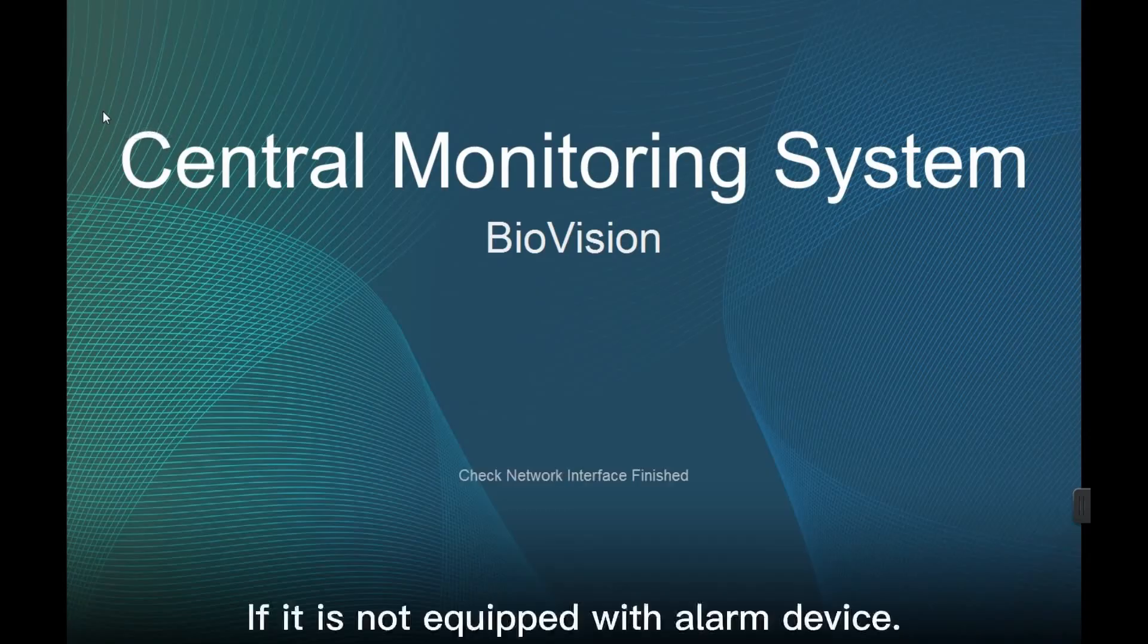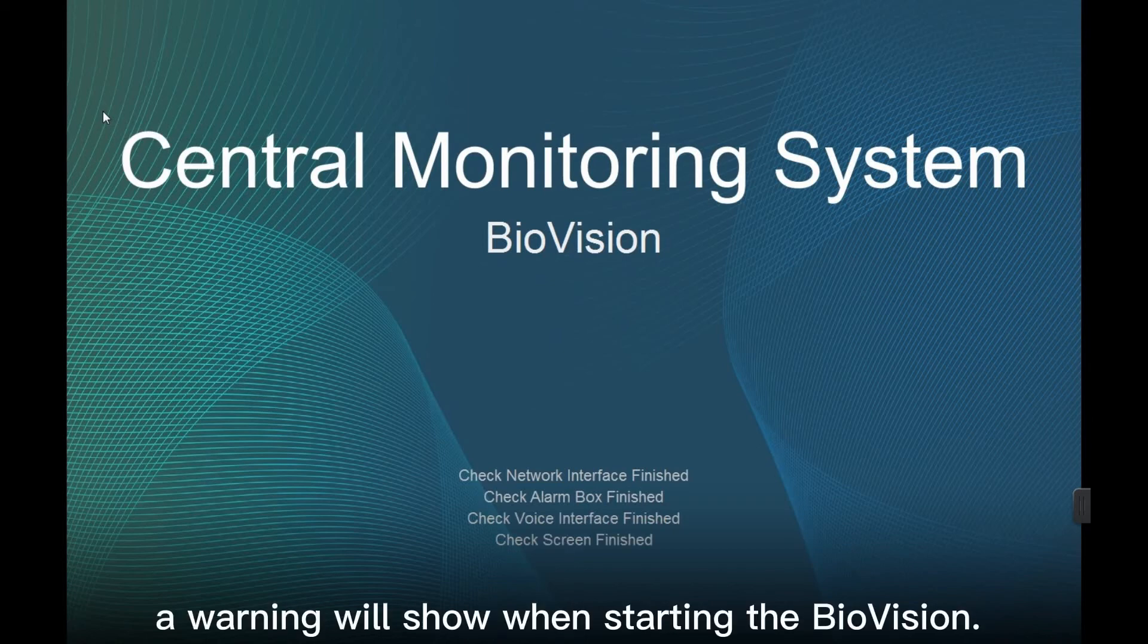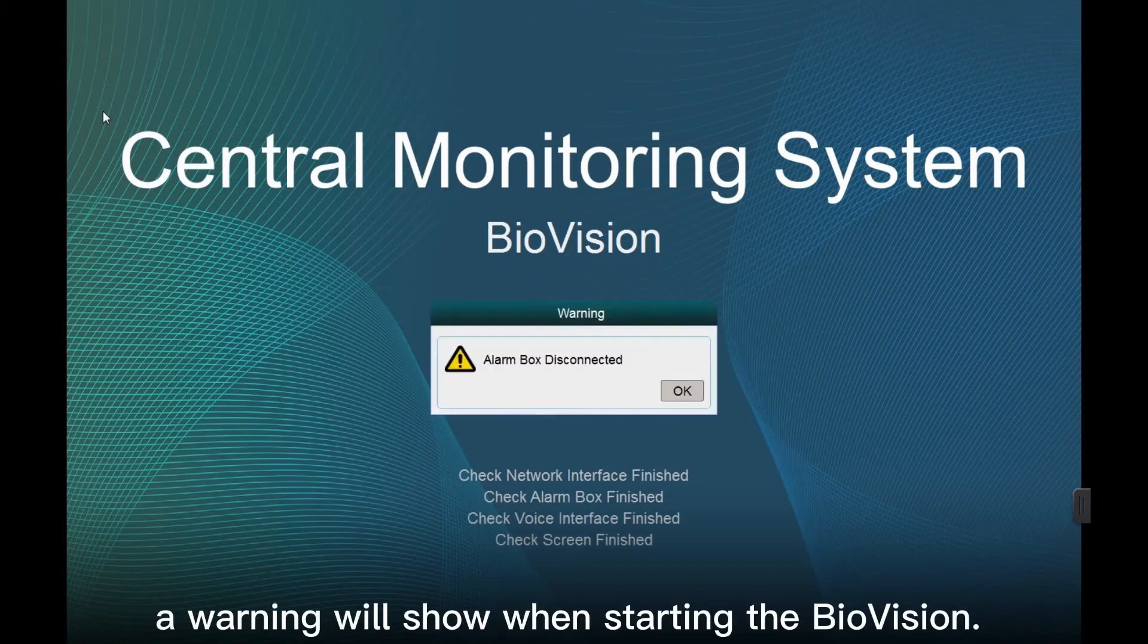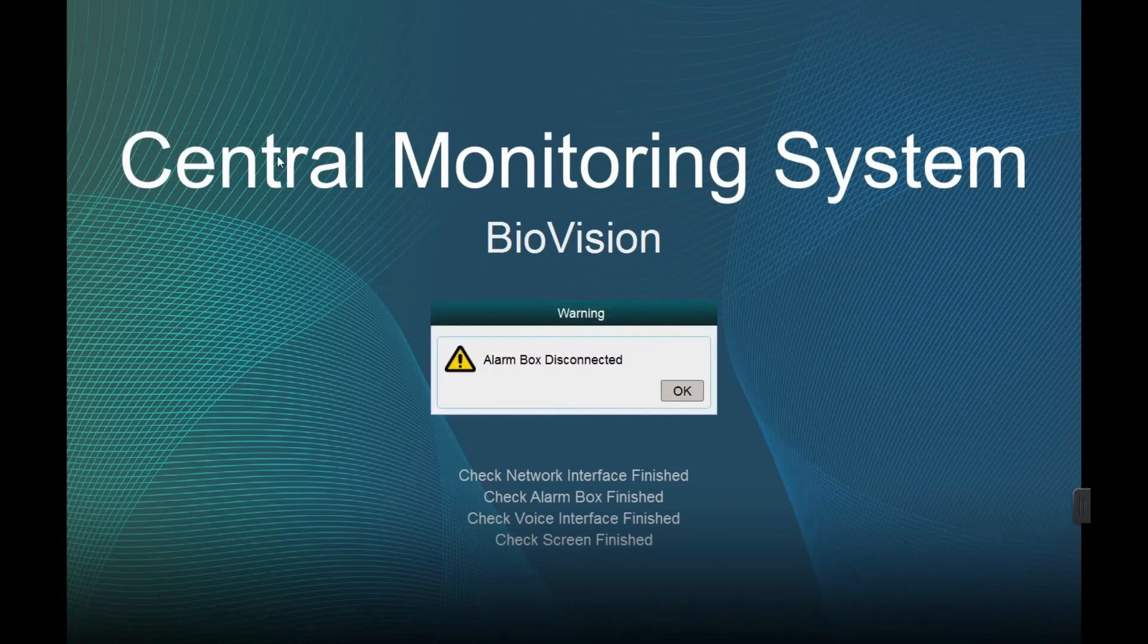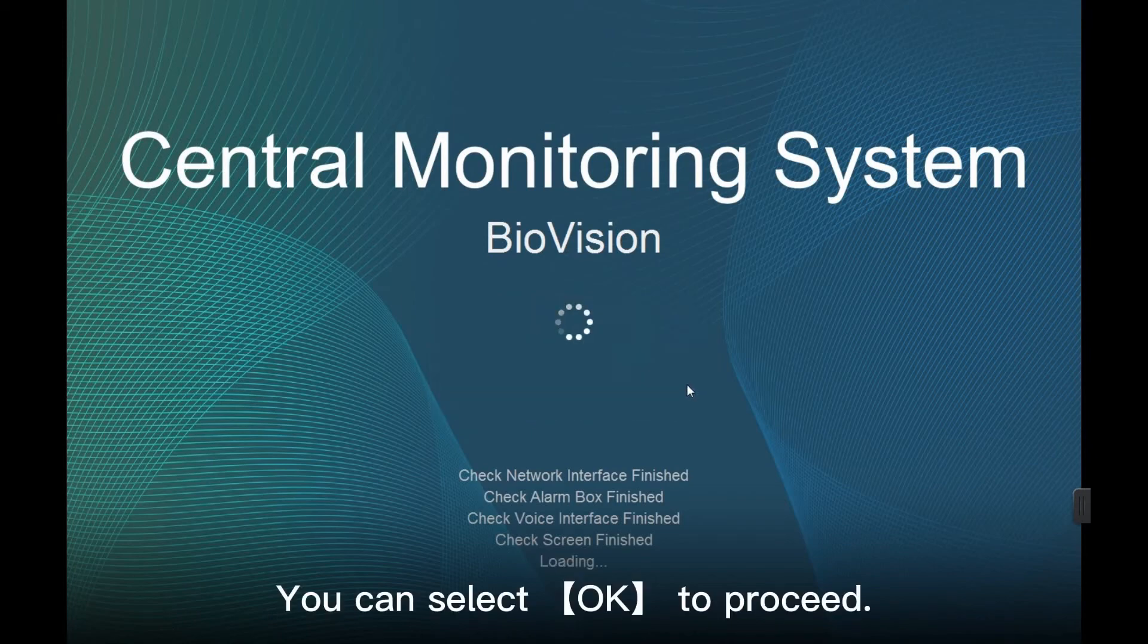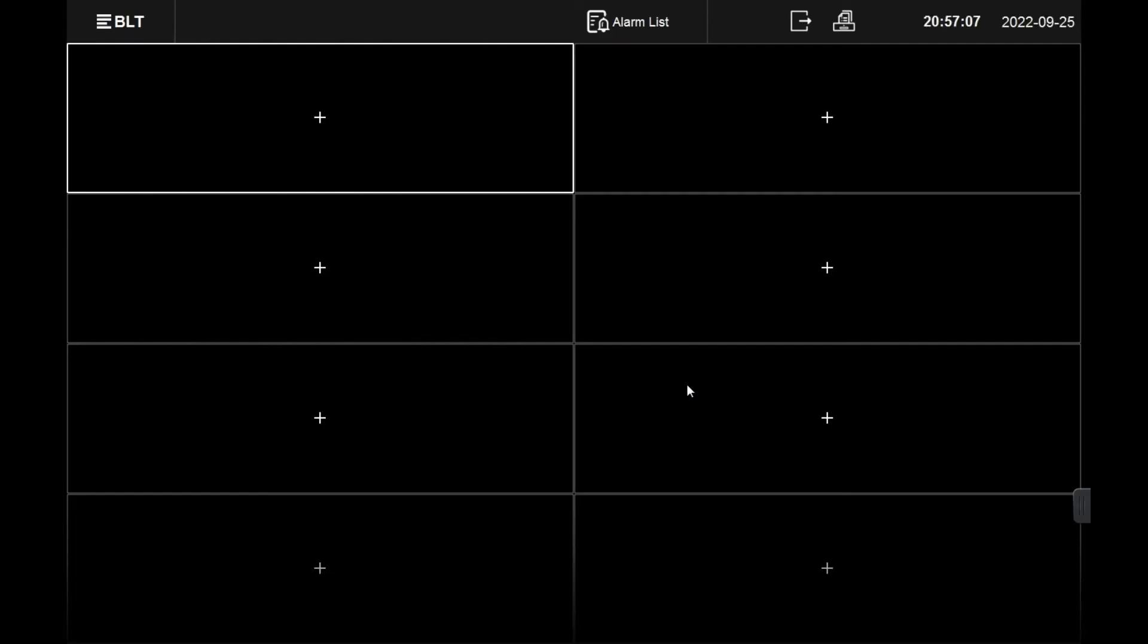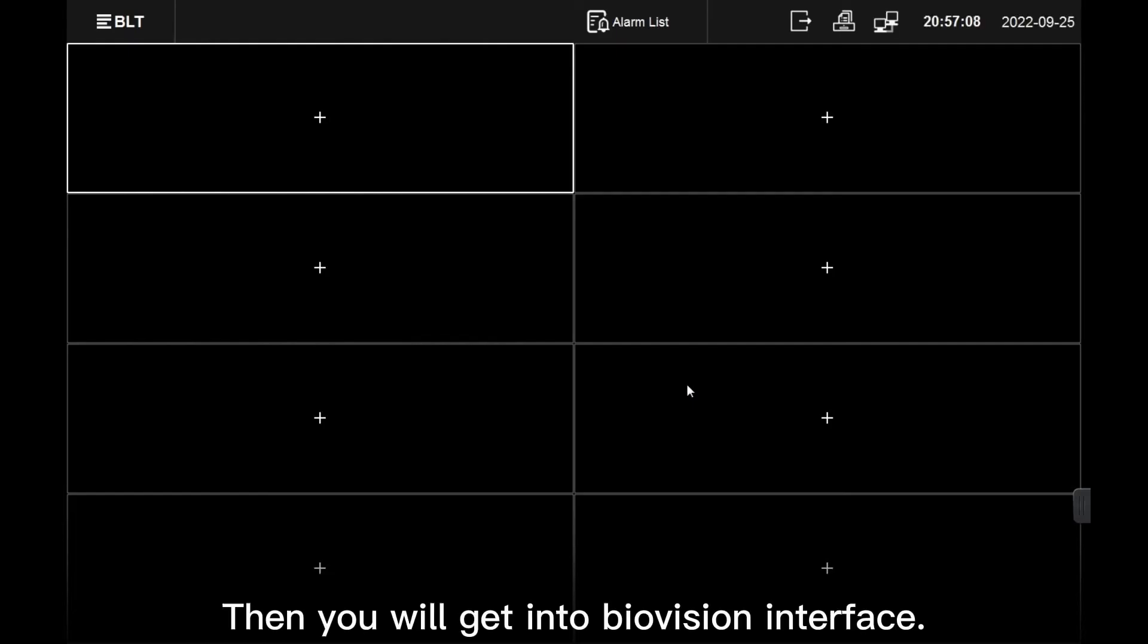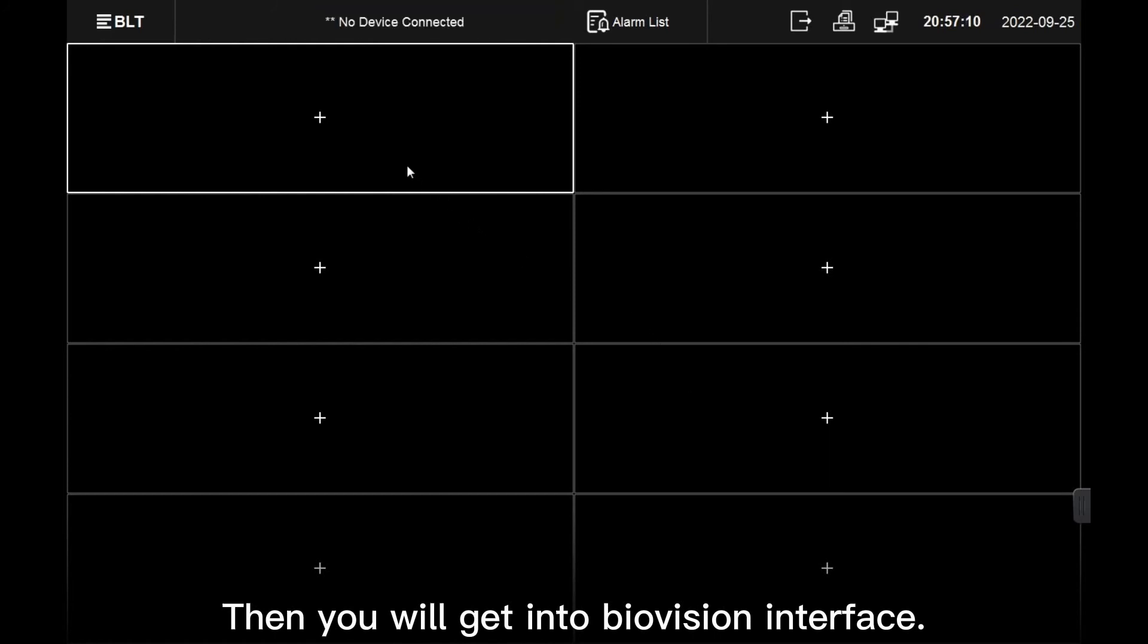If it is not equipped with alarm device, a warning will show when starting the BioVision. You can select OK to proceed. Then you will get into BioVision interface.